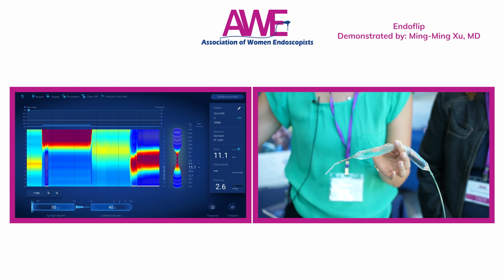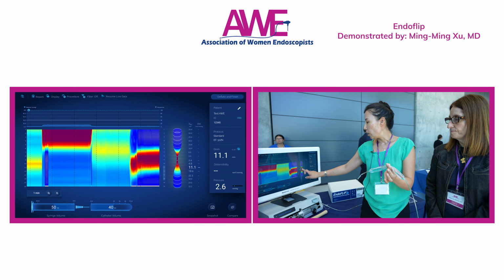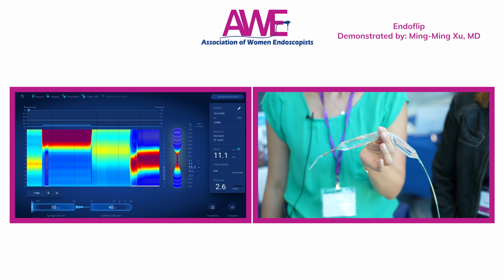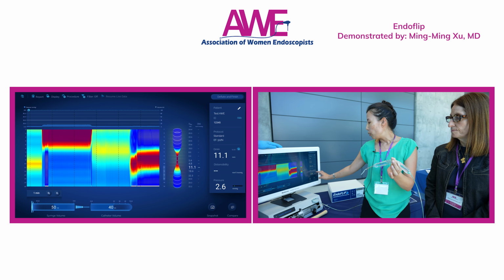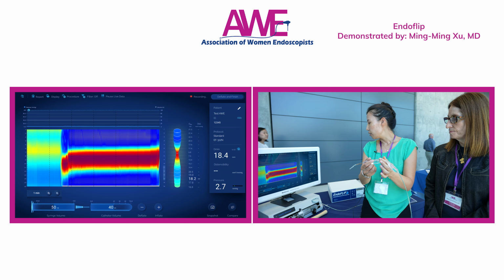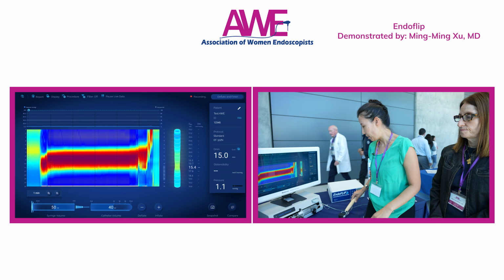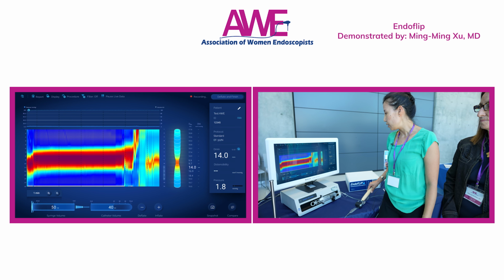Perfect. So this is the image that you're going to get on your Endoflip imaging device, and what you see here is a very tight high pressure zone in the midpoint of this catheter where my hand is pinching, but in the patient presumably where the lower esophageal sphincter is pinching. The high pressure zone is right here, and this balloon gives you a measurement right out here of both the pressure and the diameter. You can see how the data changes, for example, I have a meat masher here, if you pinch it at different points, it gives you slightly different measurements on the diameter and the distensibility.